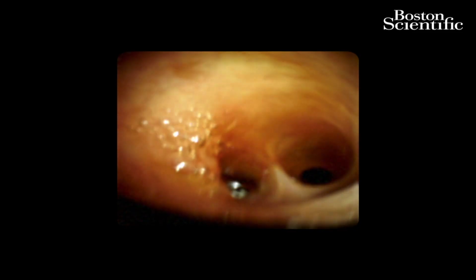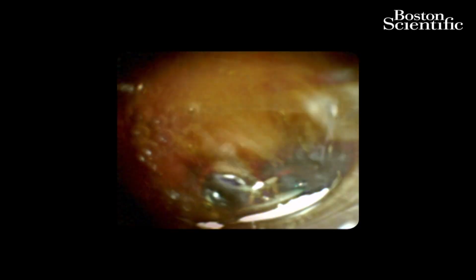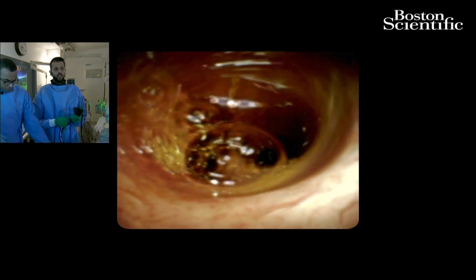So Saad now, we have removed the plastic stent previously placed. We actually introduced the cholangioscope inside the common bile duct. We are up to the common hepatic duct, seeing the bifurcation. And now Saad is going to withdraw the scope slightly to see if we could appreciate the stricture and the features that could help us identify the underlying cause.